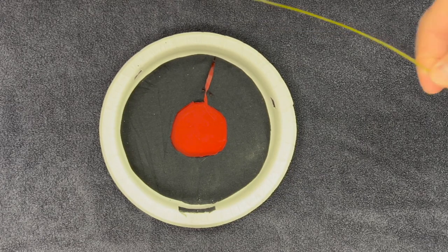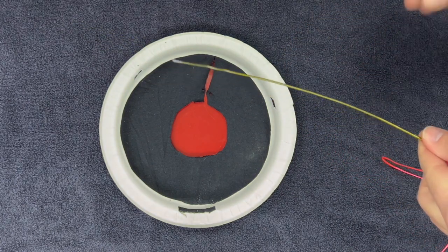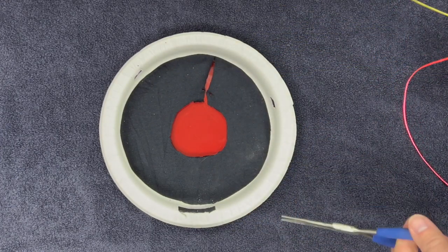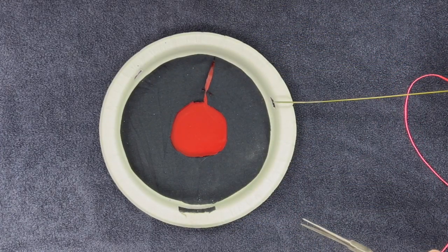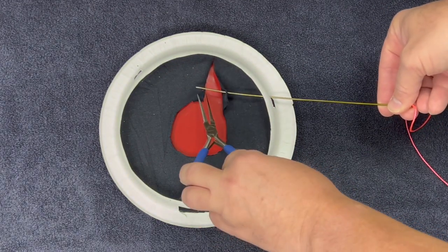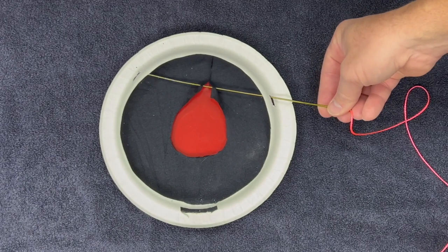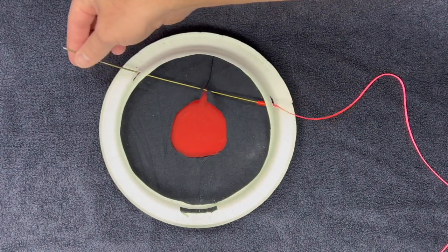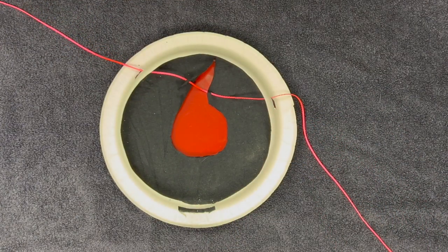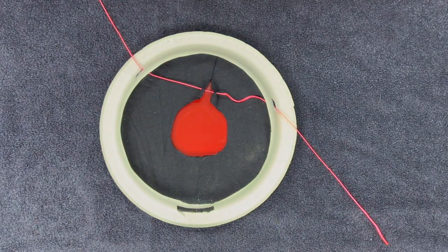When it comes to tying a sliding knot, you'll need a couple things: a 10-0 polypropylene suture and a long curved needle like the CIF-4 or CTC-6L. Here we have our paper plate model with an iris defect. We're going to put the CIF-4 needle through a paracentesis, wiggle as we go, and then through both the proximal and distal ends of the iris defect. Push this through the limbus or through a small paracentesis, make sure our suture gets through the iris defect, and pull this suture all the way through. You just want a little strand of suture outside the eye.